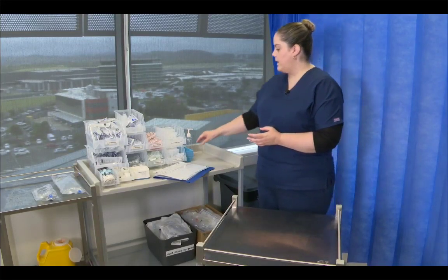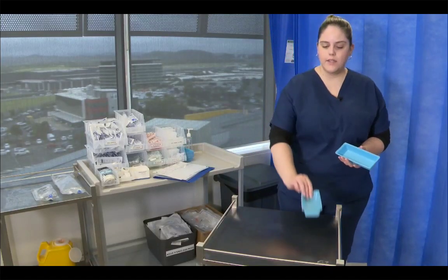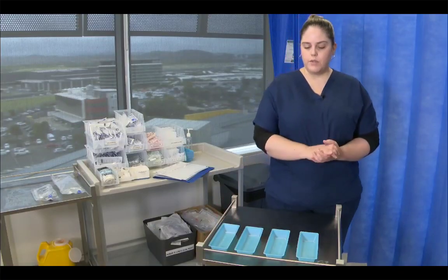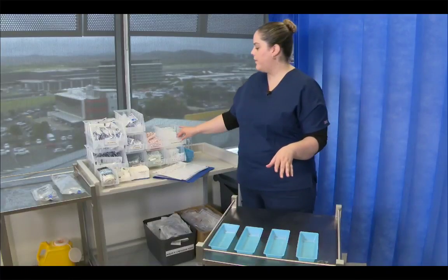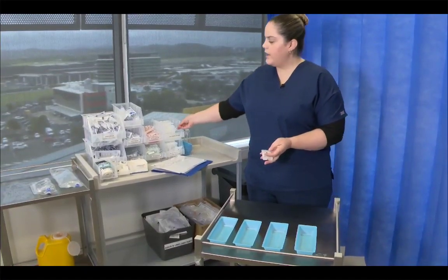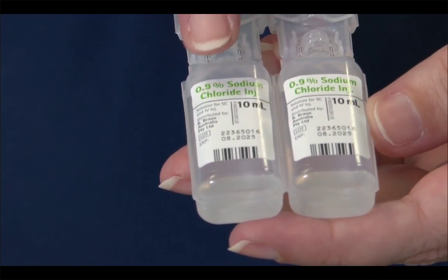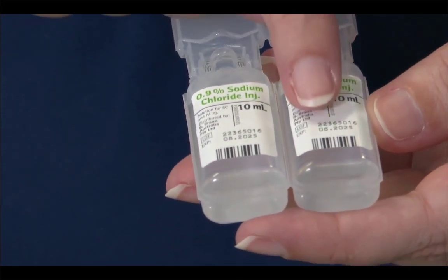I find it easiest to do this by keeping things orderly for myself, and I know that there's 4 stages, so I like to use 4 blue trays for this setup. Each of these trays corresponds to a different section of what I'm doing, but it also helps me make sure that I've collected all of my equipment correctly. The first thing I'm going to grab is 0.9% sodium chloride. And as I'm gathering each of these, this is when I'm performing my first check. So I'm looking that I have 0.9% sodium chloride. Each of these is for a flush and expires 0.8, 20, 25, and each is 10 mils.